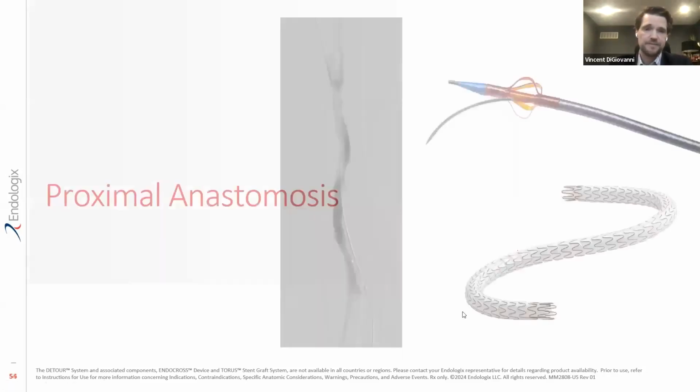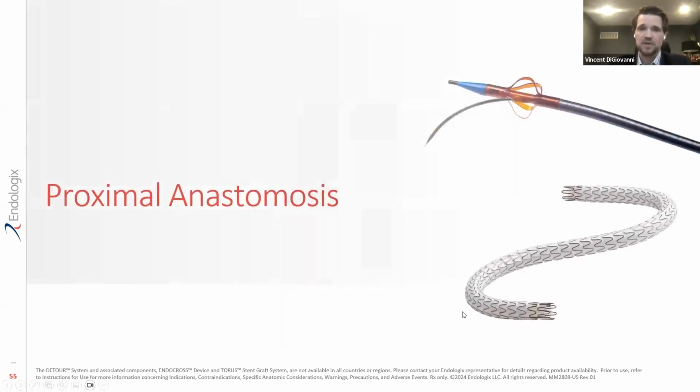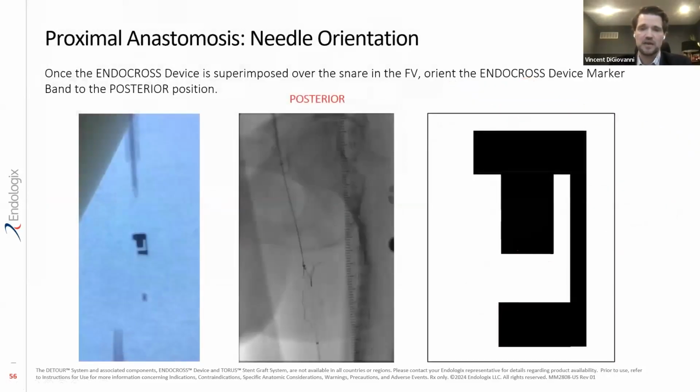And I think maybe perhaps somebody that's braver than me will do it and see what the outcome is. But for me, that's something that makes me very nervous. And that was actually one of my initial concerns once I started talking to people about doing these cases, I was worried about what was going to happen to the vein. And I can tell you that almost all of the people that we treated, with the exception of perhaps one person who ended up having a deep venous thrombosis, all of the patients had no significant swelling. They have reperfusion swelling, but nothing that would concern you for deep venous thrombosis.